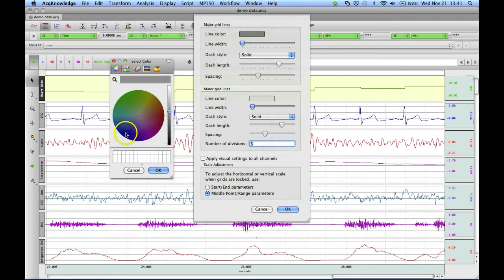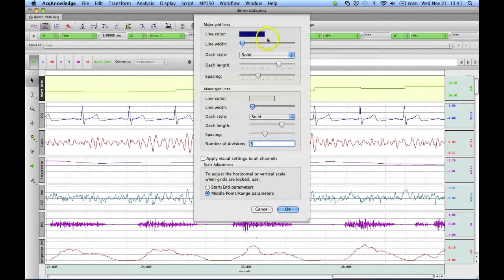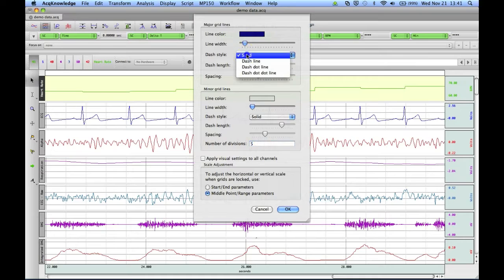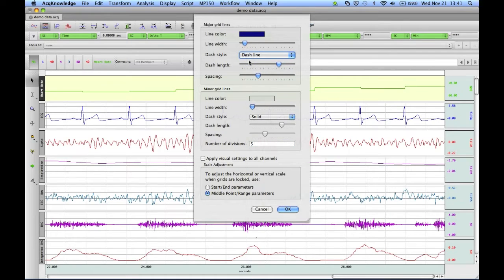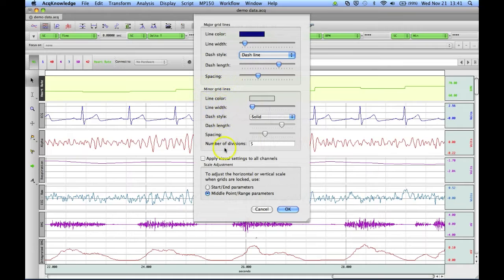For example, I could instead make our grid lines blue and thicker, and we could turn them to dashed lines. And we could also do this for the minor grid lines if we would like.